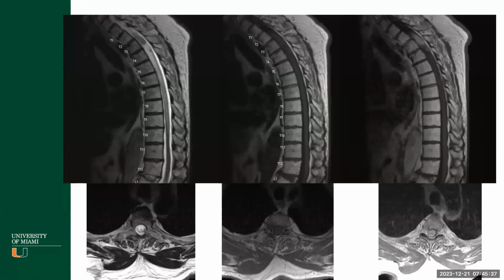Looks like there's a lesion in the upper thoracic spine, spanning T1 to T3 or T1 to T4. Describe it in T2, T1 and contrast terms. It's T1 hypointense, and on the T2 and FLAIR it's hyperintense. It looks like T2 and then contrast, right? On the axials, it looks intradural, intramedullary, I think. Perfect.